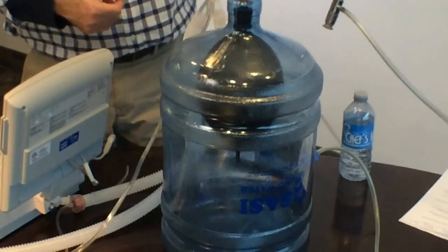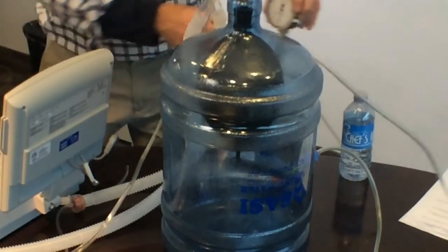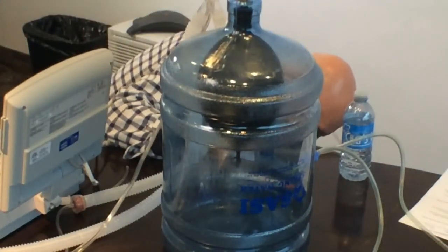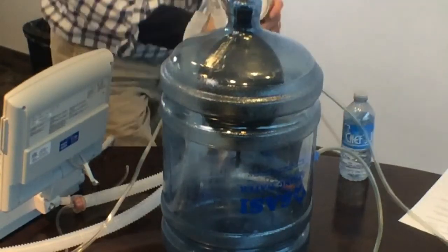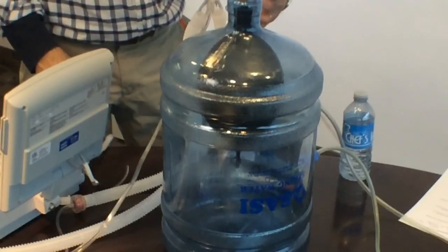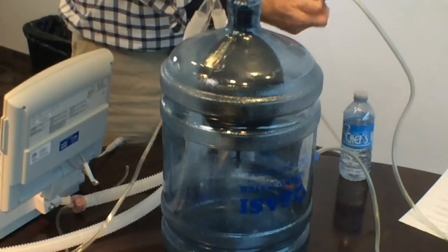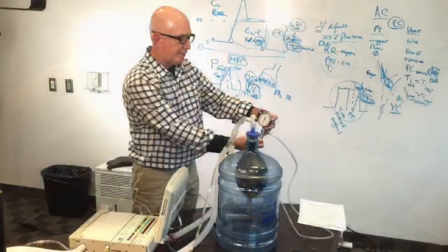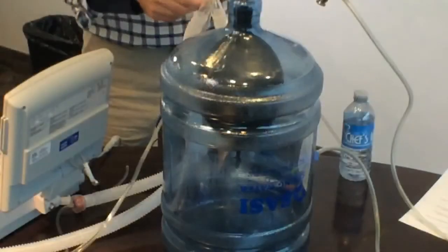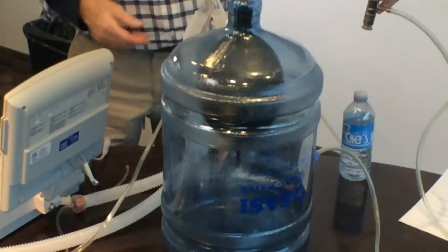And you can see as well that, and I'm not quite sure that happened, but our pressure external is 0 on this system as well. So I'll have to see what's happened to my flow here. Okay, so we're getting closer to 10 again. Trying to be careful here not to let too much pressure build up in this, because to have this explode at the end of the presentation is not the dramatic finish that I'd be looking for.